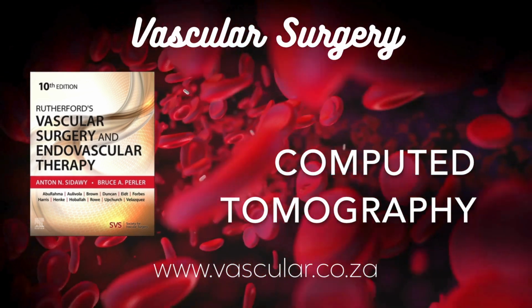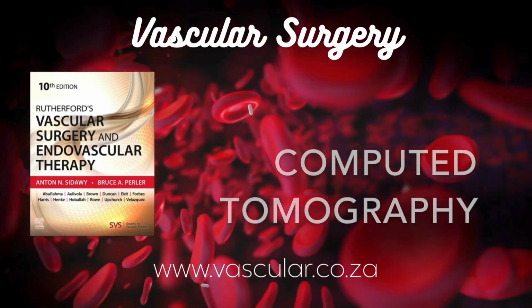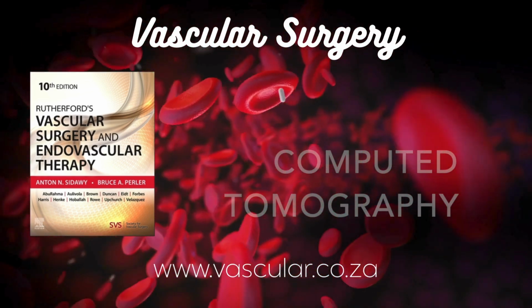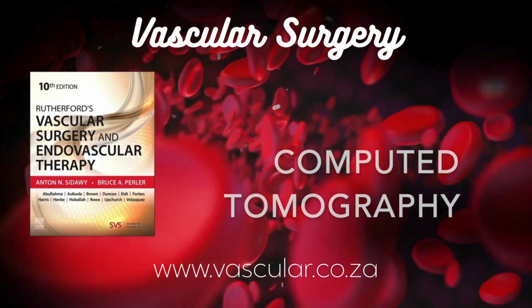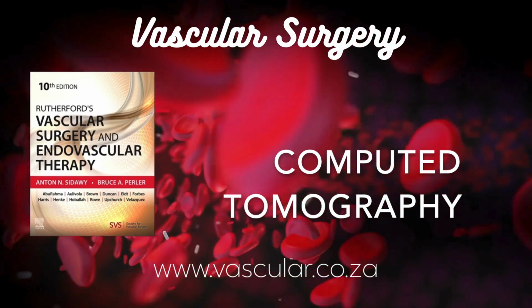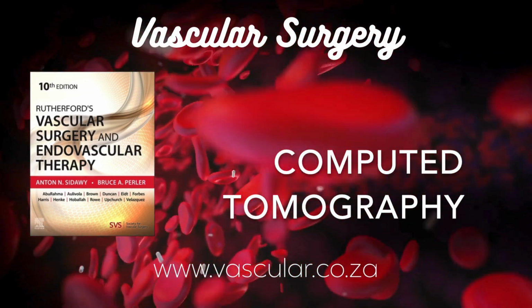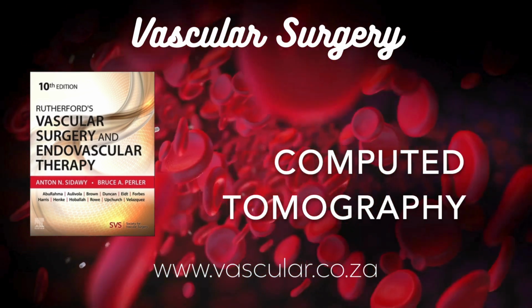So what was the first crack at solving that before CT? There was this earlier technique, planigraphy or just tomography. It was actually pretty clever for its time. They physically linked the x-ray tube and the film on opposite sides of the patient, and then they'd move them in opposite directions, pivoting around a specific point inside the patient. So like a seesaw motion. Sort of, yeah. And the effect was that structures right at that pivot point stayed sharp, stayed in focus, while everything above and below that plane got blurred out.